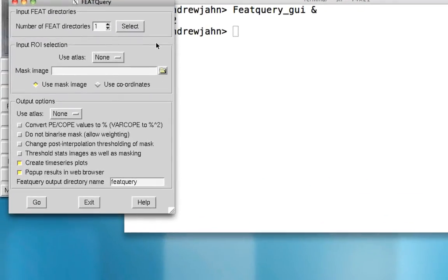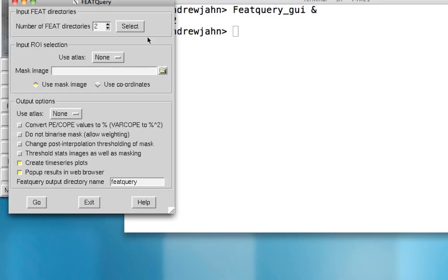Now if you've already analyzed all the runs within a single subject, you can extract parameter estimates collapsed across all of those runs. In this case, I want to extract data from the right motor cortex for the contrast of left minus right and right minus left.